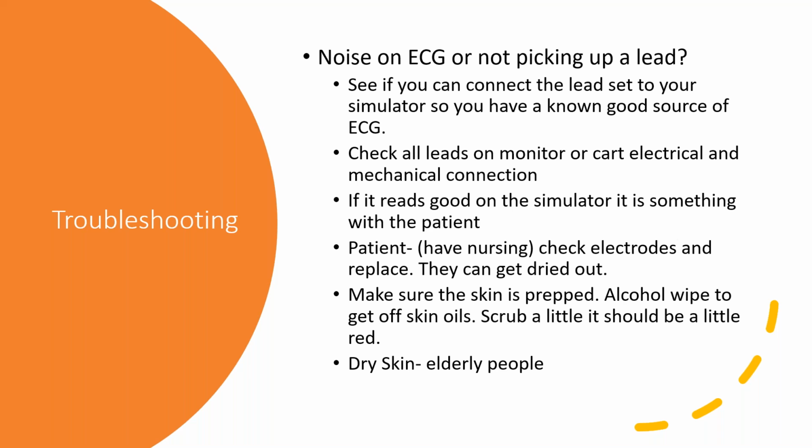Troubleshooting. Noise on ECG or not picking up a lead. See if you can connect your lead, the lead set, to your simulator. That's like the number one thing we want to do as a biomed, so we have a good standard. We have our calibrated test equipment that we're going to hook it to, so we have a known good source of ECG.